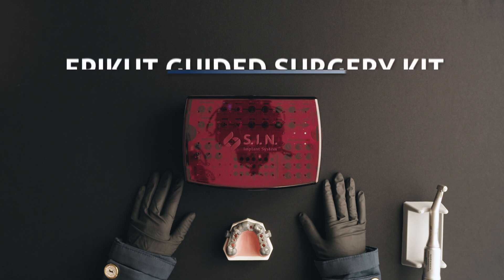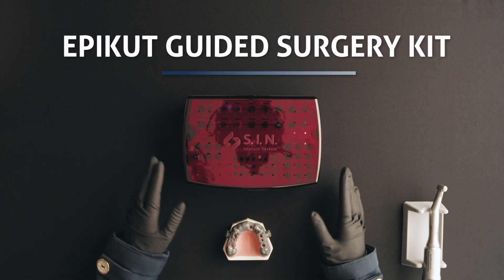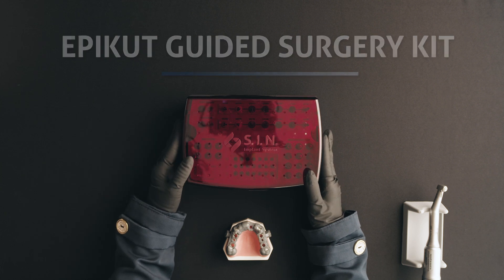Hi! Today we will talk about the guided surgery kit of the Epikut line, using a drilling sequence as an example.